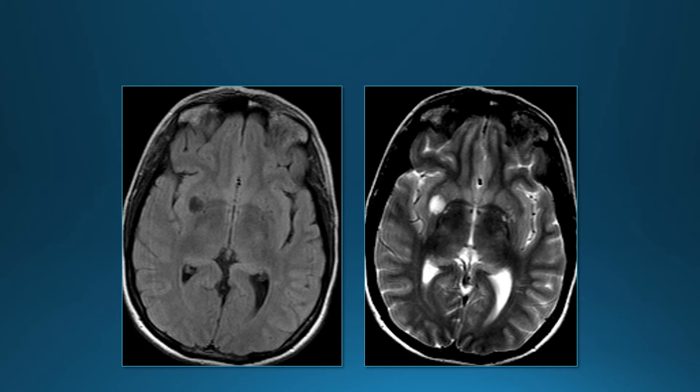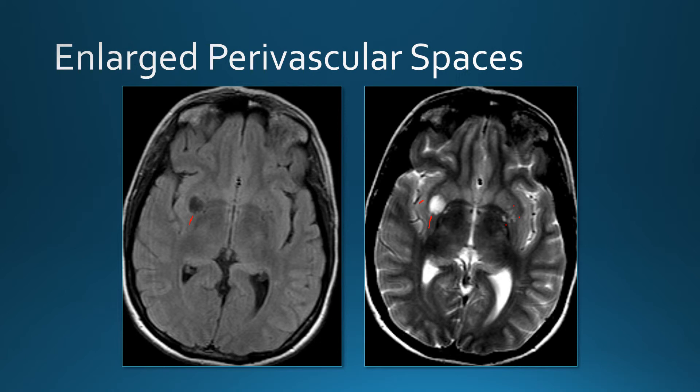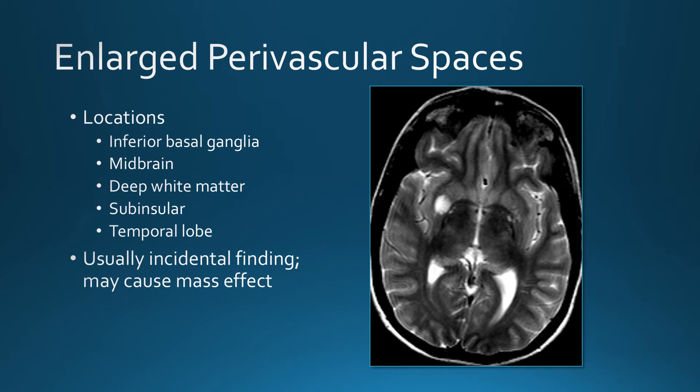Lesion in the basal ganglia, similar to CSF on FLAIR and T2. You can also see a few other small dots in the basal ganglia with similar signal — these are enlarged perivascular spaces. They occur in a number of locations; the most common is the inferior basal ganglia. They can also occur in the midbrain, deep white matter, sub-insular region, and temporal lobe. This is generally an incidental finding, though there may be associated mass effect when they get large.